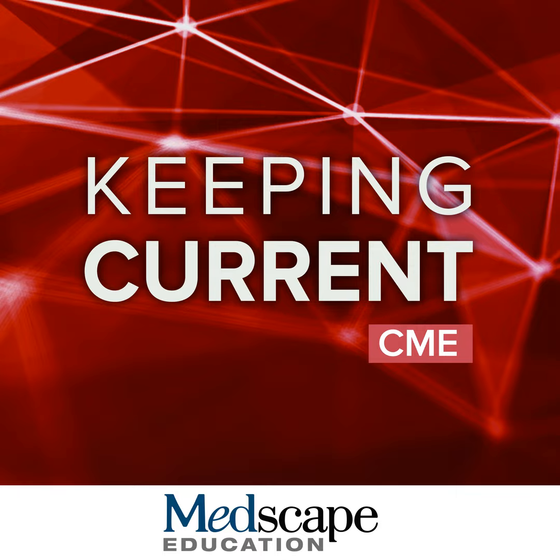And to optimize AP quality, either use multiple AP acquisition or a low power injector rate with one-to-one dilution with saline. Example of multiple AP acquisitions, you can see that we can choose to focus on the one that has least motion and optimal timing. If you don't have multiple acquisition for arterial phase, this is a great option when we dilute gadoxetate 1-to-1 with saline and slow down power injection to 1 milliliter per second.